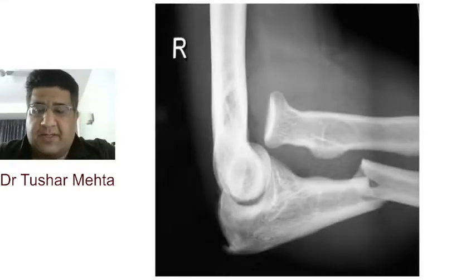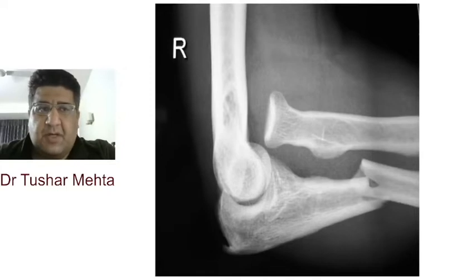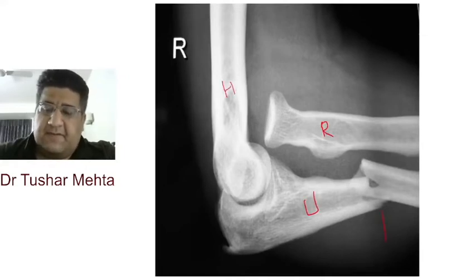The first fracture we have to talk about is this one. Whenever you see a fracture, your first job is to identify which joint it is. This is the elbow, lateral view. I can see the humerus, I can see the radius, I can see the ulna, and I can see a fracture here.